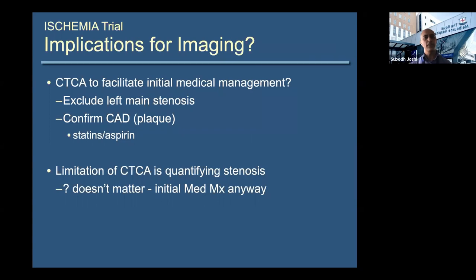Because I think it's got implications for imaging. I wonder in particular if CT should be used to facilitate initial medical management, that is, to exclude left main stenosis and to confirm coronary artery disease, particularly to allow initiation of things like statins and aspirin. And one of the main limitations of CT, as I mentioned earlier on, is quantifying stenosis. But if someone's symptoms aren't that bad, maybe it doesn't matter that much if it's a moderate or a severe stenosis, if they're going to be trialed with medical therapy anyway.